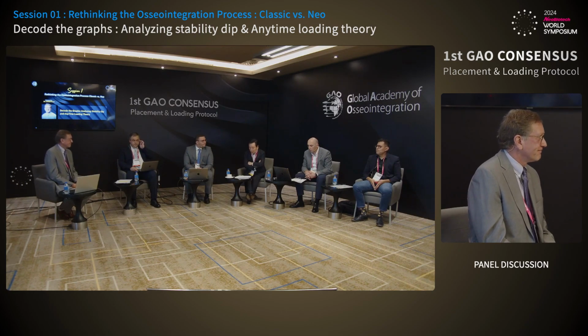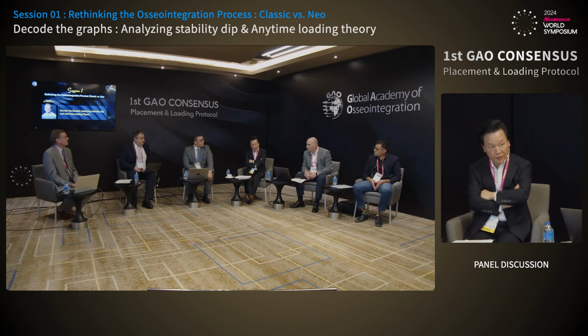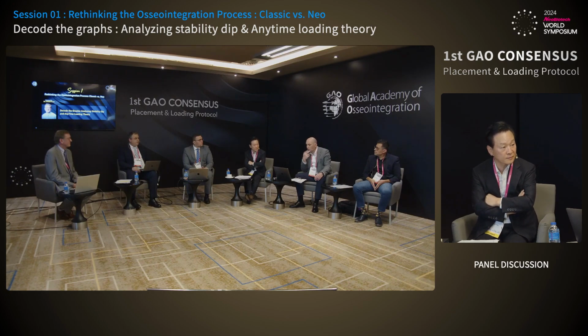Yeah, thank you. I think most of the studies show that if we get over 40 Newton centimeters in insertion torque, we can do the loading. But most dentists do not do immediate loading. They want to wait about 3 to 4 months, even though they get over 40 Newton centimeters. And then the question is why? We have to have a good initial stability for waiting for 3 months. So if you get 30 newtons, then you can do the loading. But nobody believes that. Why?